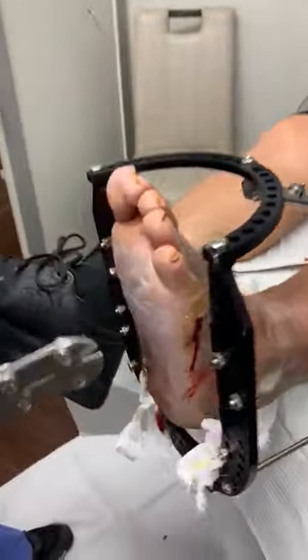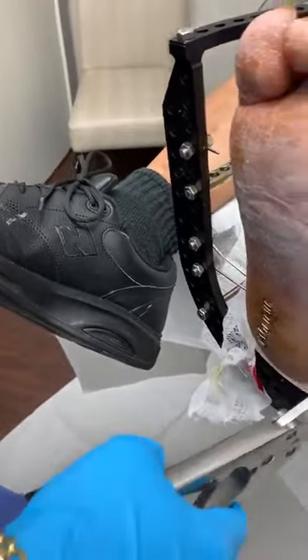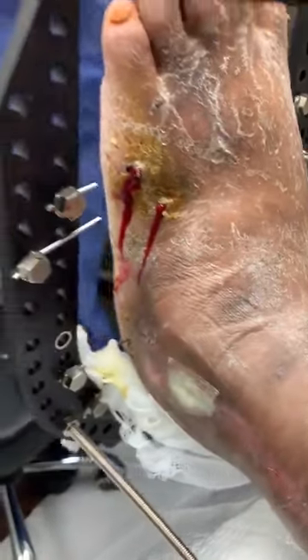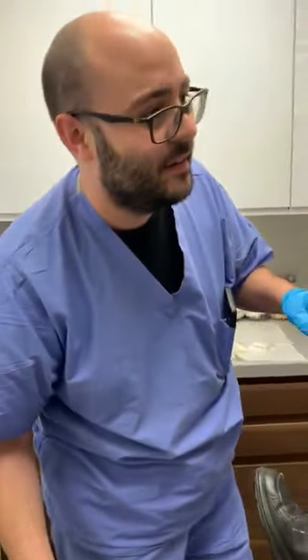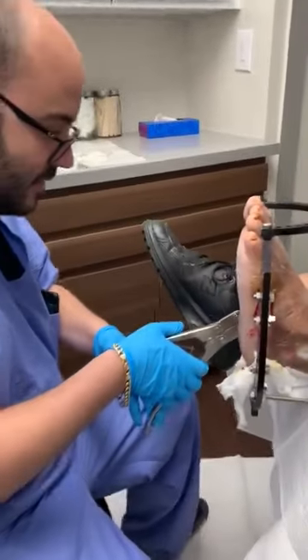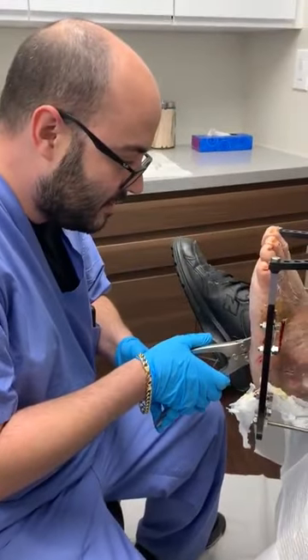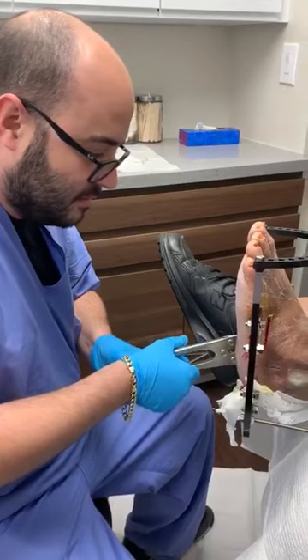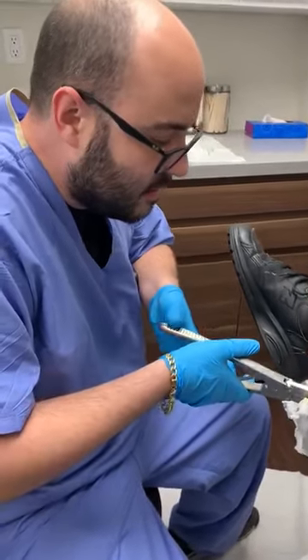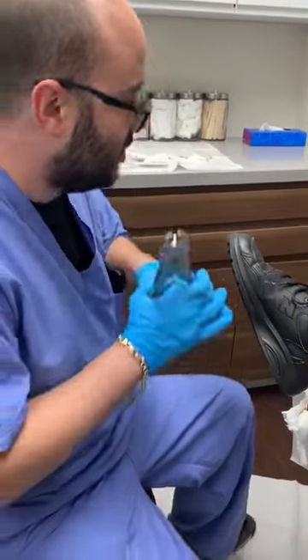That was me clipping a pin. There's the other one. Let's try it over here. And the last one. Done.